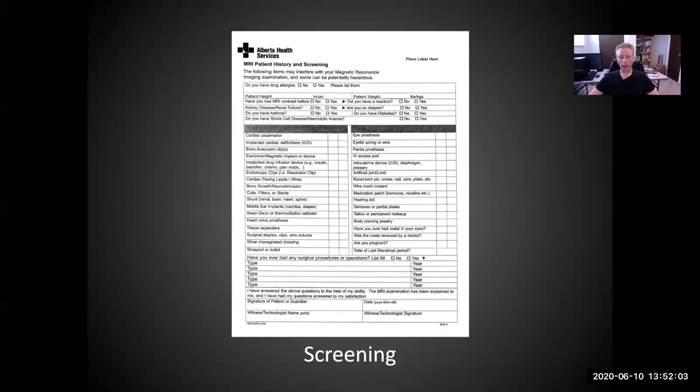And the other issue with respect to braces is that they will almost certainly cause image artifact in the facial area. So your particular study may need the data of the facial area or be concerned about the loss of image quality. And so it definitely should be brought up with the study lead.